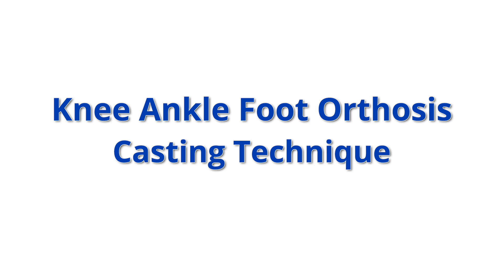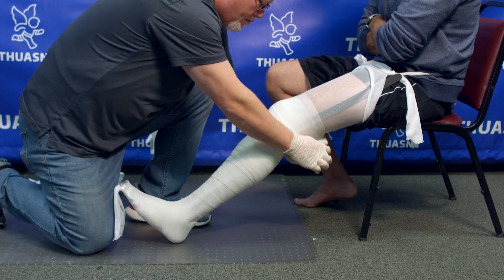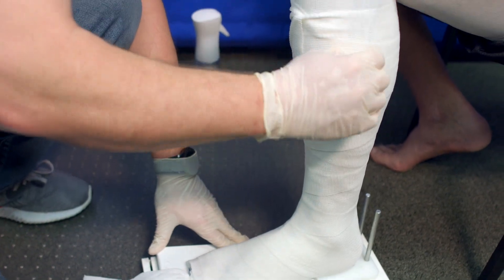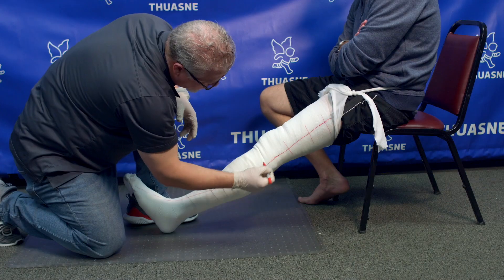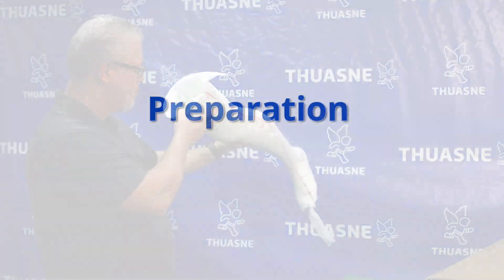Knee-Ankle-Foot Orthosis Casting Technique. Please follow these casting instructions when ordering a custom KAFO. A quality cast allows us the best opportunity to create a brace that will fit your patient perfectly.